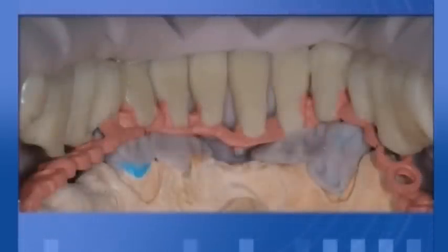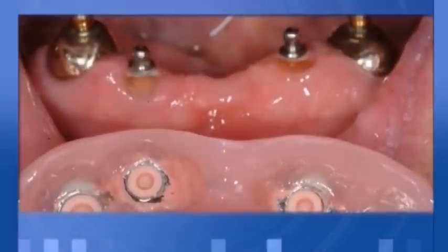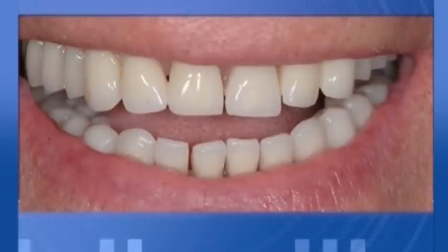With this simple OT cap technique, it's possible to make stable and strong quality dentures with time and cost savings, especially with expensive materials like investments, silicones, and so on.